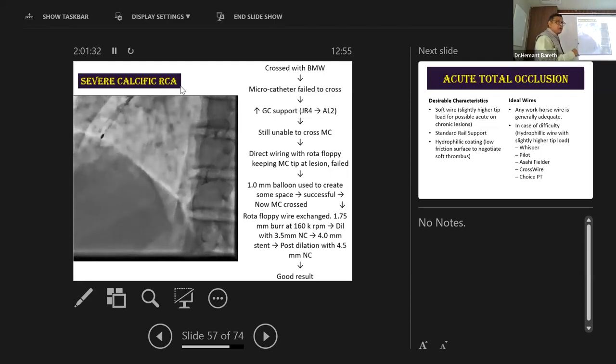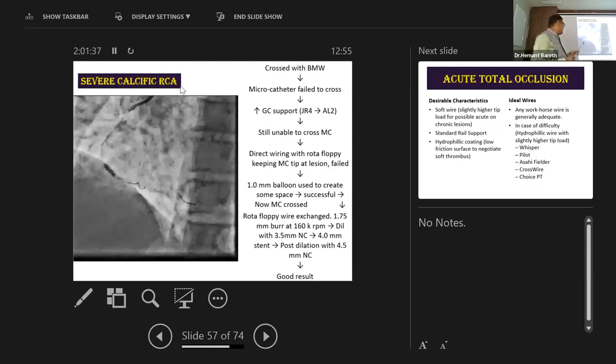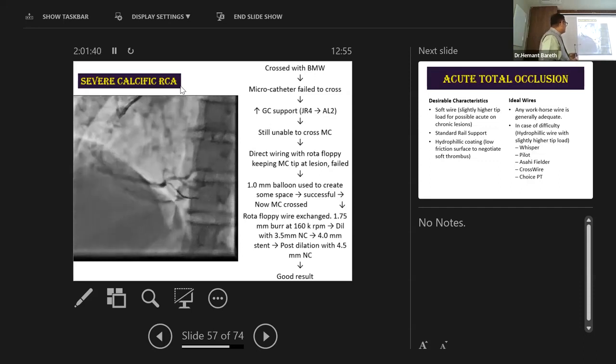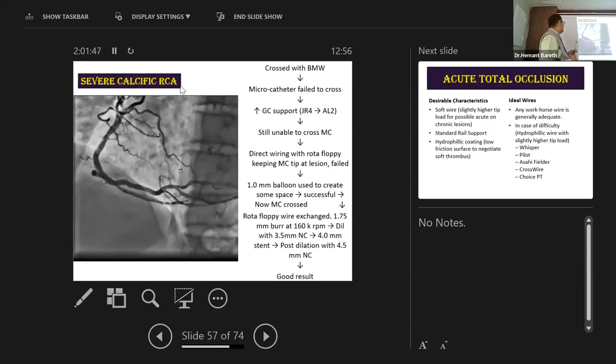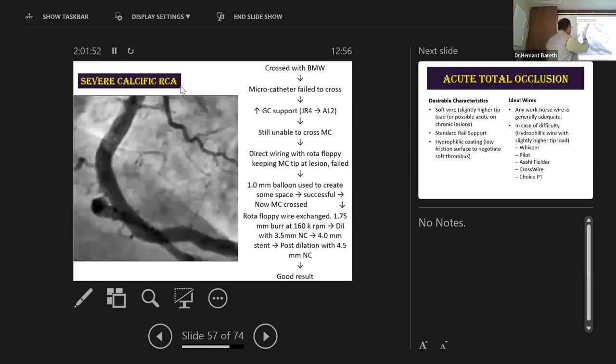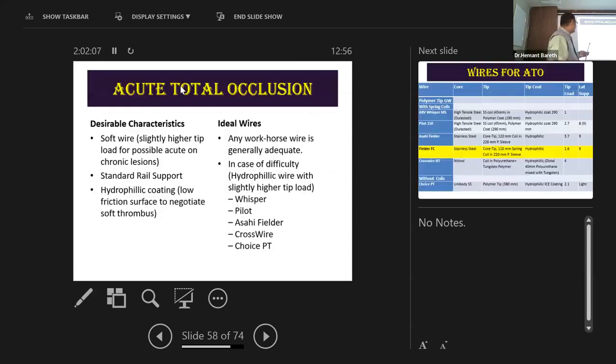And then after rota, with a microcatheter exchange with another wire, or you could put another wire if it is nicely open, then balloon, and now a nicely prepared lesion, ballooning different parts. Post-dilating after rota is very important. And then this is the final picture. So you can see that because the vessel was straight, this magnified view was done to see whether there is any tortuosity at all. And because there was no tortuosity at that point, that is why the rota wire was taken, and that is how it was done.